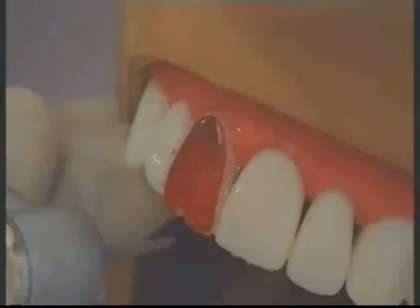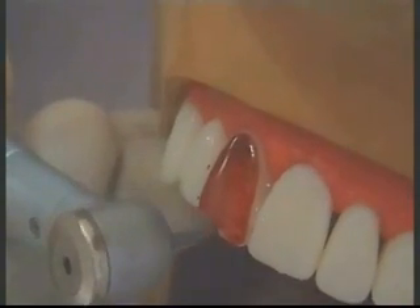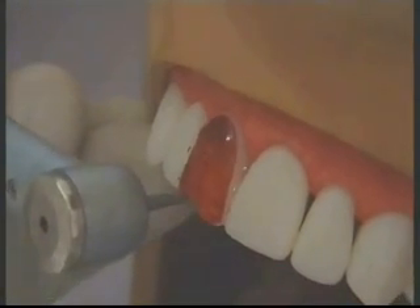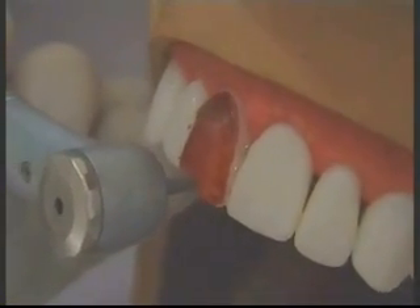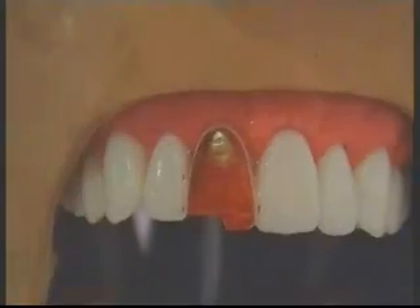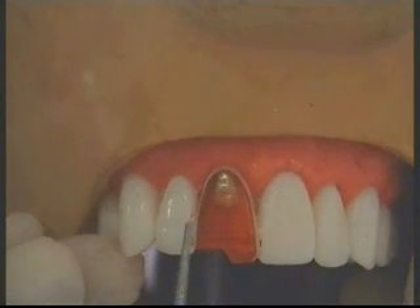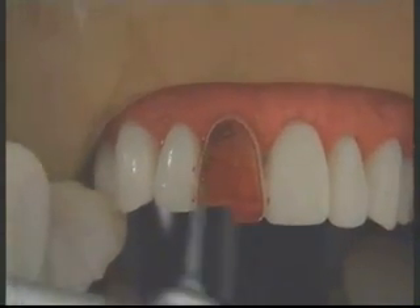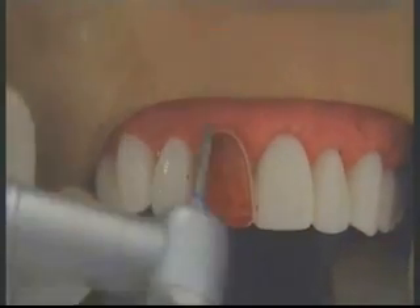Watch the direction of the bur — I am not placing it flat. I am making sure that the direction of the bur creates an inclination which is favorable for the loading. We are doing a half-preparation, keeping one half as our guide and preparing only the other half. We have prepared the incisal reduction on one half, and we are now going to proceed with the labial reduction on the other half.